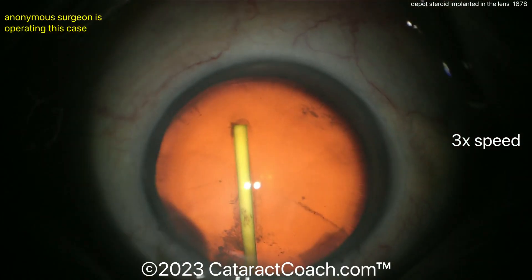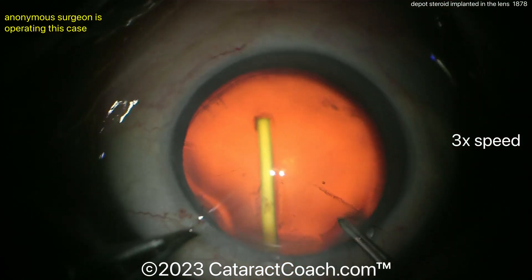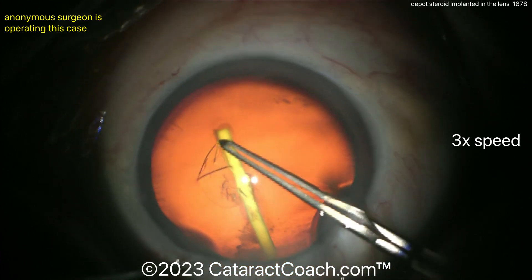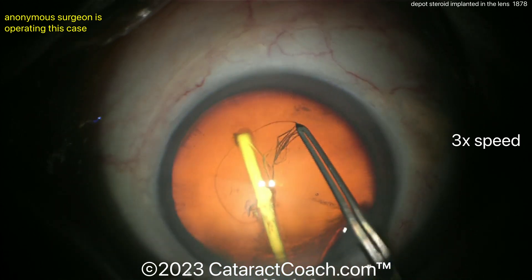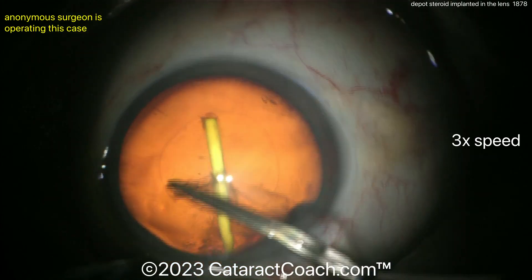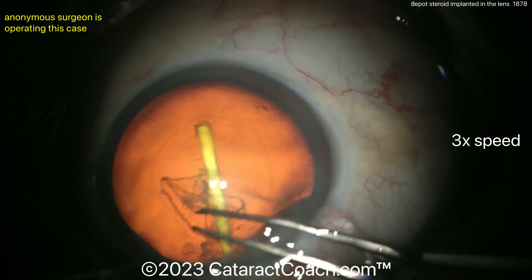The video was sent to me already edited; I've just sped it up to about three times normal speed so we can see the entire case in about five minutes. How would you do this case? I'm watching it with you for the first time.